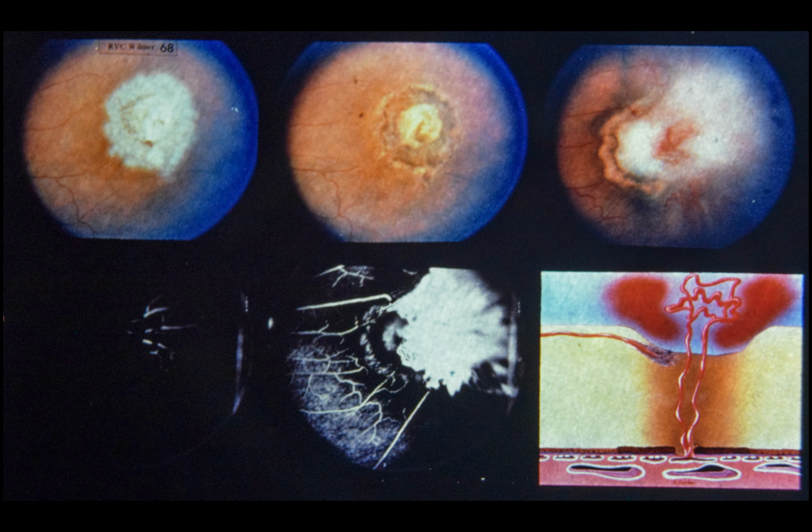During treatment, a break in Bruch's membrane was created. This break was then surrounded by intense photocoagulation to prevent further hemorrhage or neovascularization from this area. Upper left is a photograph taken 1 hour after photocoagulation. 1 month later, note photocoagulation scar, upper center.